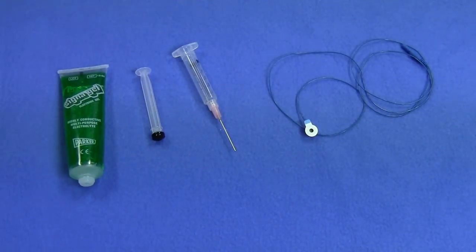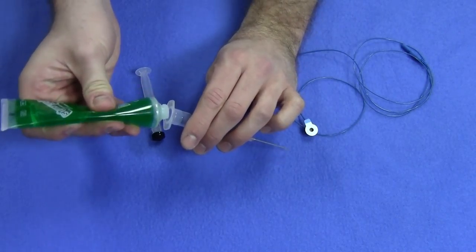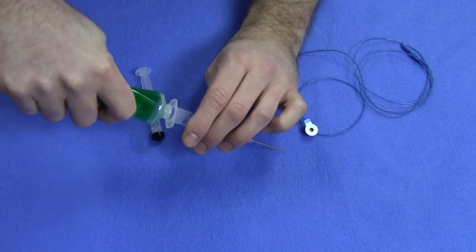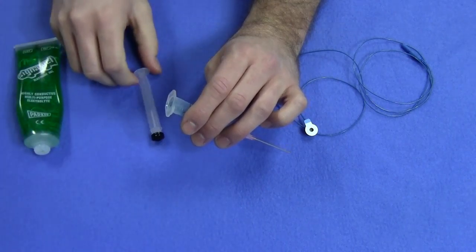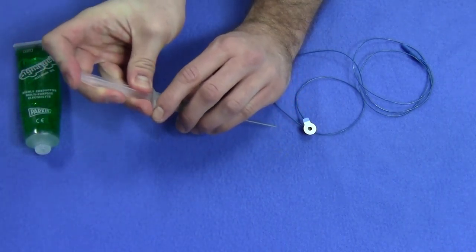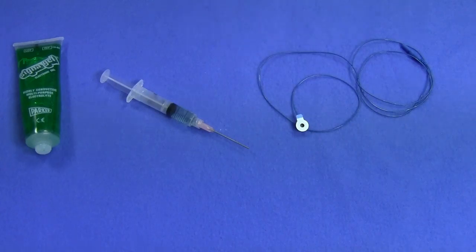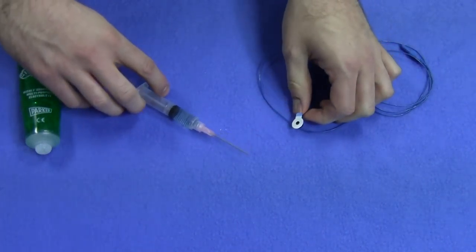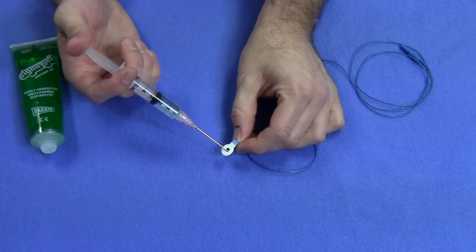Next we need to fill the cap with conductive gel. We'll use a syringe to control the flow of conductive gel as we fill the cap. Take the syringe and fill it with the conductive gel. Doing this at an angle will allow the air to enter, making it easier to fill. Once the syringe is filled, it's time to fill the electrodes. Be careful not to over or under fill the cap with gel. You want to fill it until there's a small bubble of gel emerging from the hole in the center.